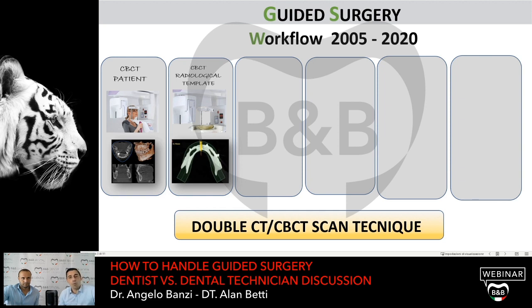You can use the prosthesis of the patient, if the patient already has a prosthesis in his mouth, or if you want, you can create a new prosthesis and duplicate it in orthodontic resin, or the resin for the prosthesis, it is the same thing, it is not a problem. You can duplicate it and put the radiopaque markers on the radiological template. The best thing is to use the prosthesis with the teeth. Why this?